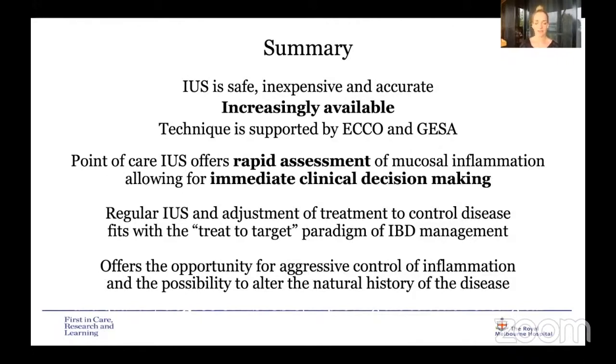Regular intestinal ultrasound with adjustment of treatment to control disease fits with our treat-to-target paradigm of inflammatory bowel disease management. It offers the opportunity for aggressive control of inflammation and the possibility to alter the natural history of the disease.